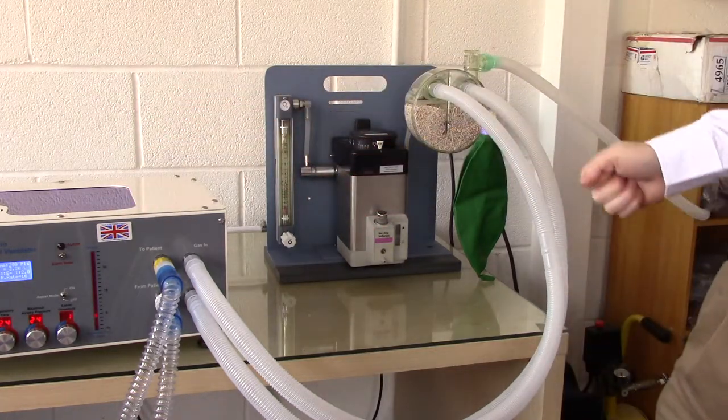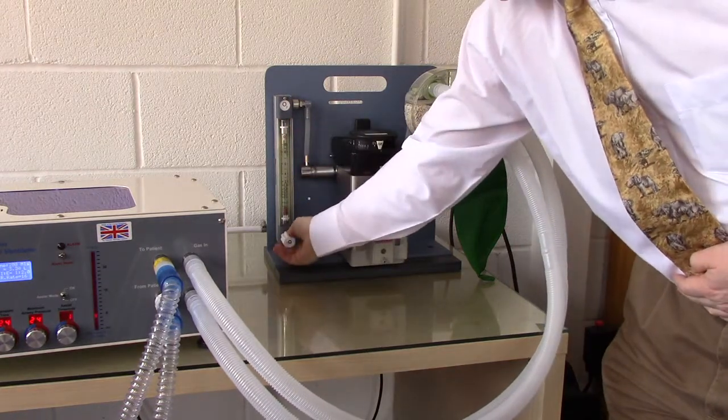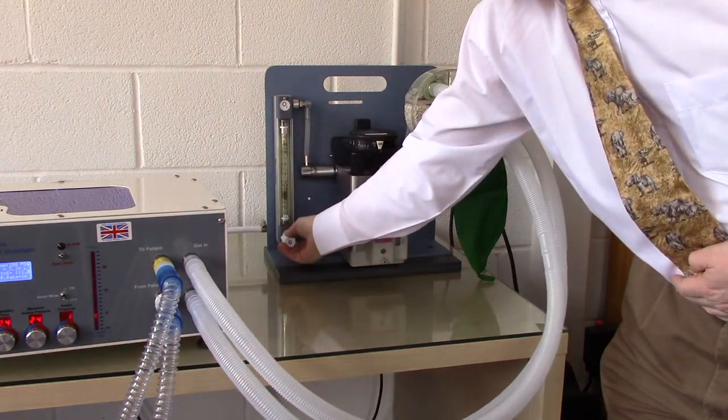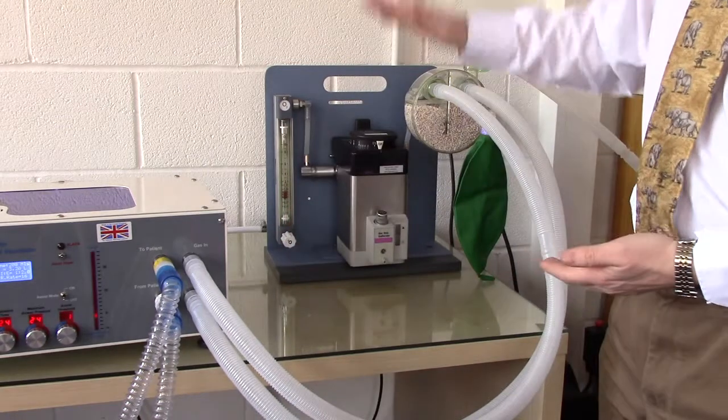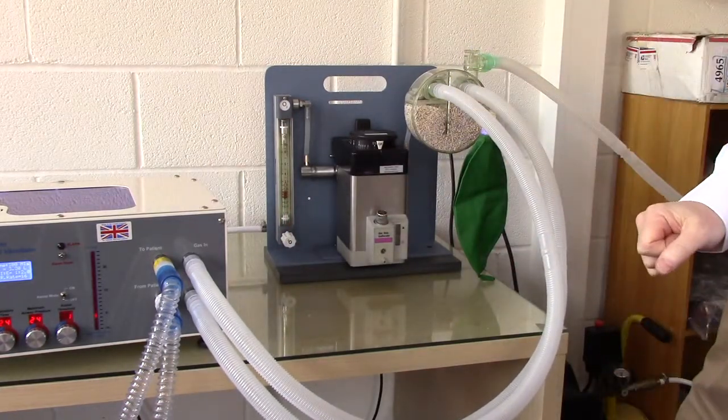So this is the tubing setup for a typical circle configuration. Set the fresh gas flow rate on your rotameter or flow meter to at least metabolic requirement, typically higher, and the gas passes through the vaporizer in the normal way. We are now ready for ventilation.